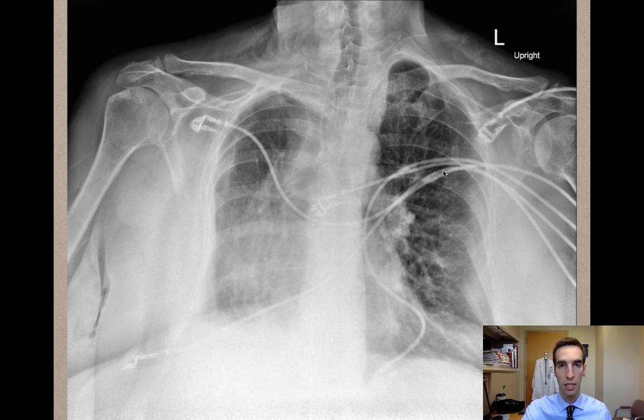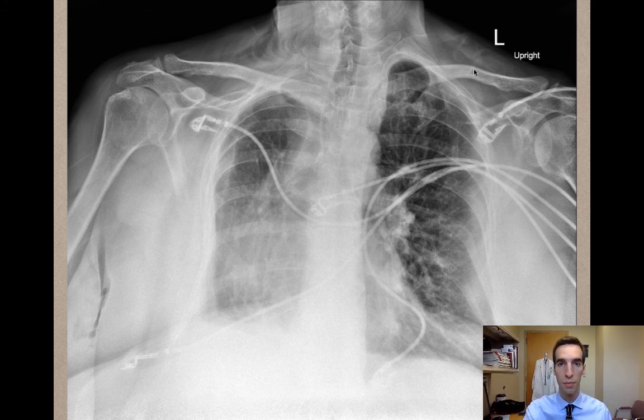Next, let's take a look at the bones. It looks like the clavicles are asymmetrical, meaning that the patient might be tilted.